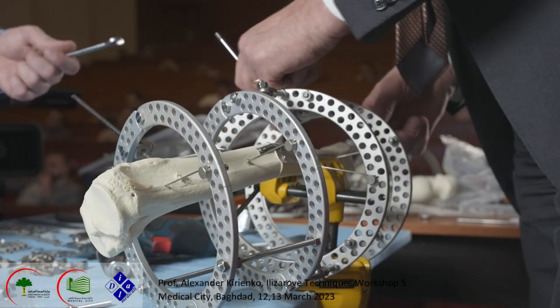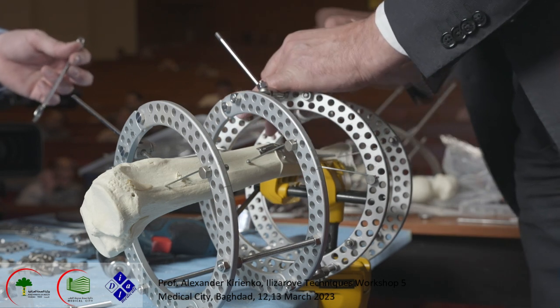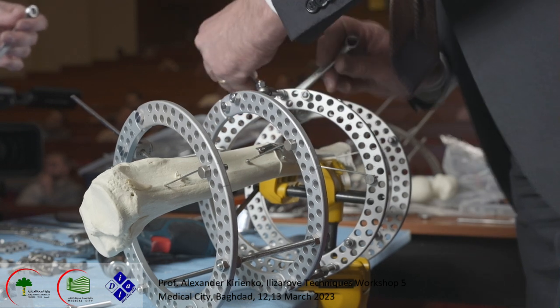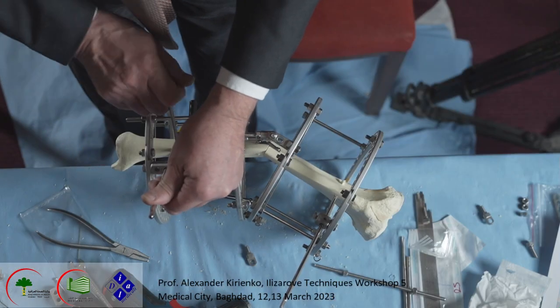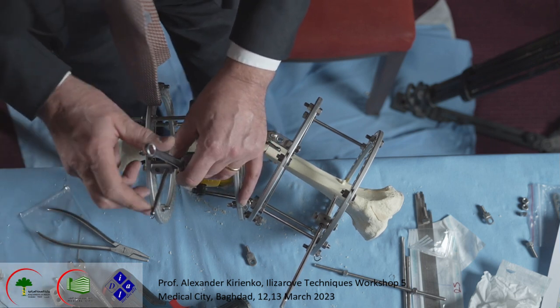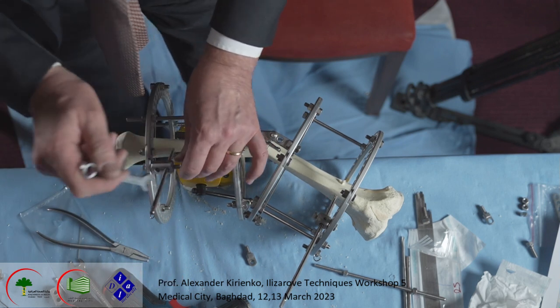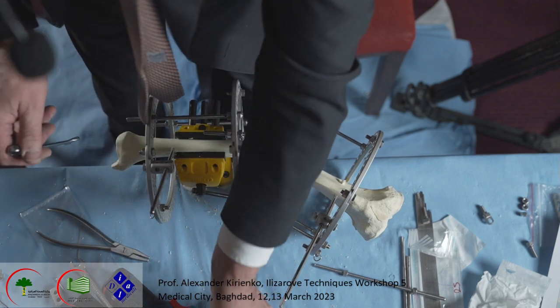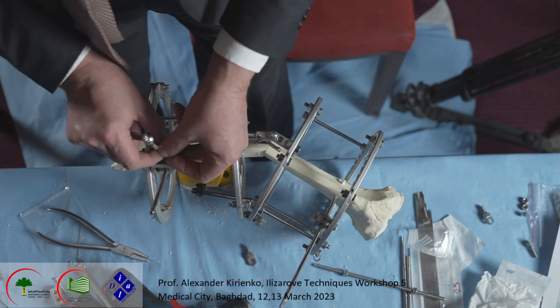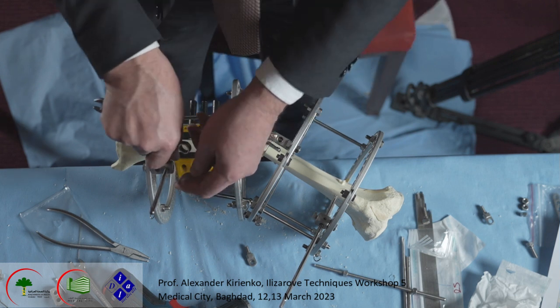In this case of malunion, we will fix the fibula with a big Kirschner wire, 2.5 or 3 millimeter.